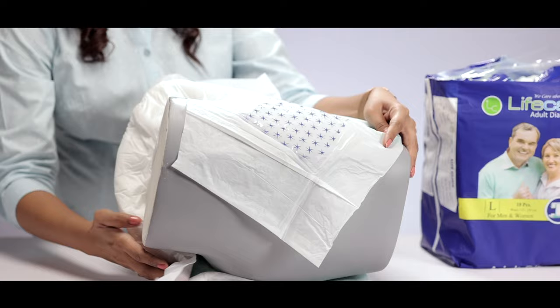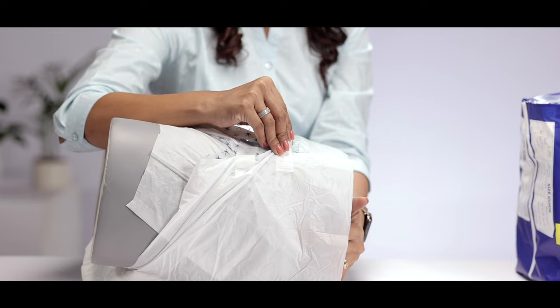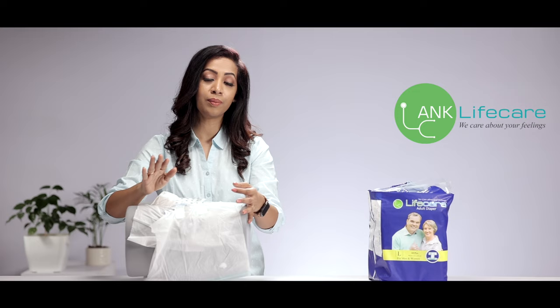Once the diaper is well opened, pull the front part towards the front of the patient and make sure the legs are snugly fit. Once it sits snugly on the patient, open the white and blue side tapes and stick them exactly on the front tape as indicated.